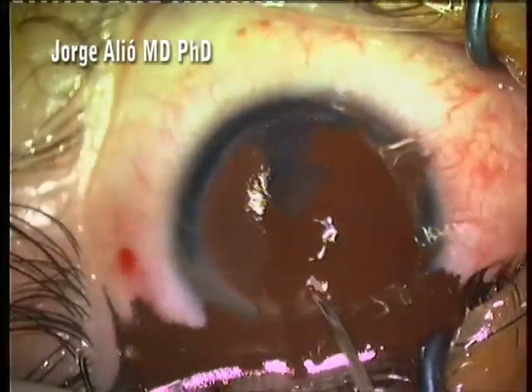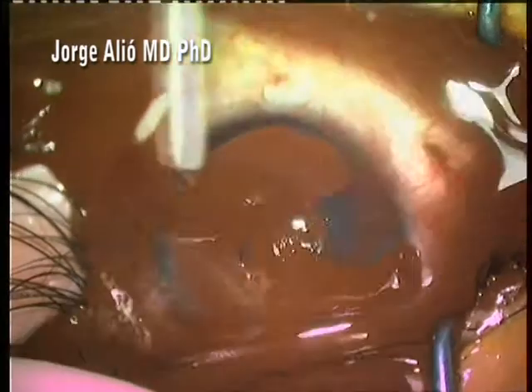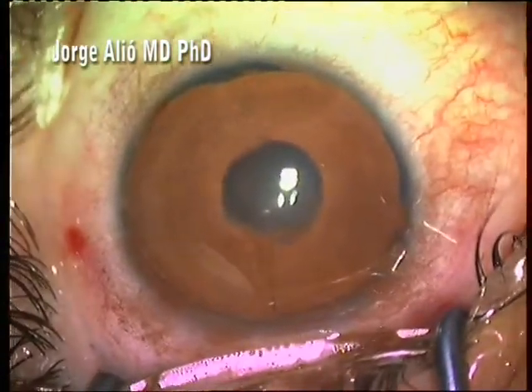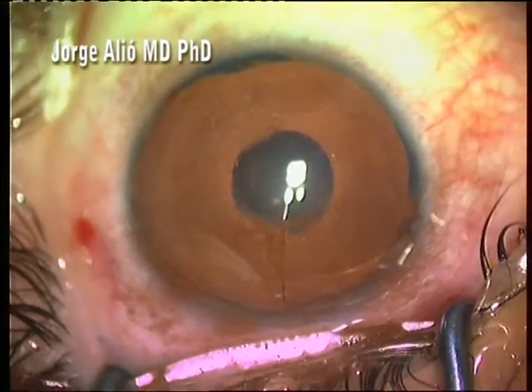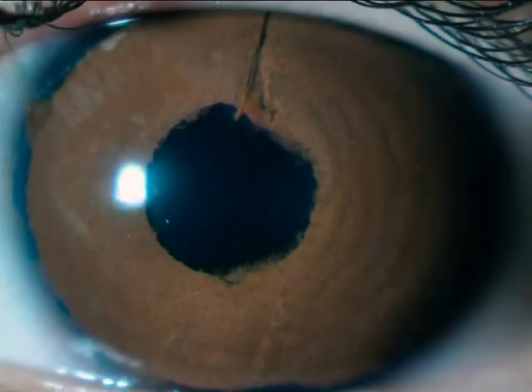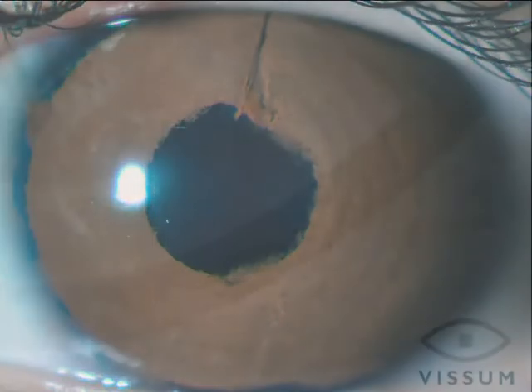We are now injecting the dark brown pigment that was created for the purpose. This pigment is customized to the iris color of the other eye of the patient, and this is the end of the surgery in real time. The patient did very well, and this is the postoperative appearance at 1 week. No signs of inflammation, and particularly the patient was happy and with no functional disability.